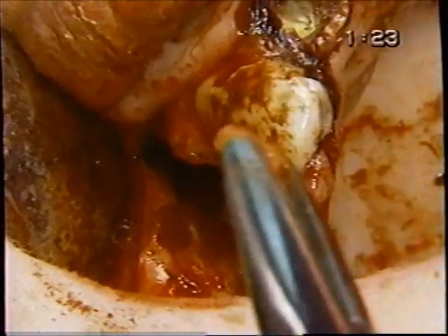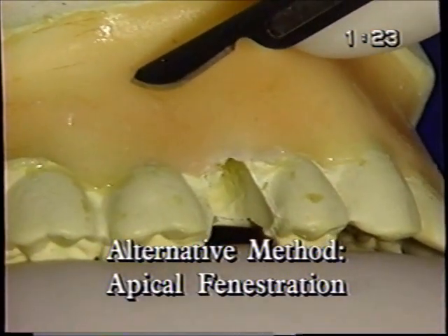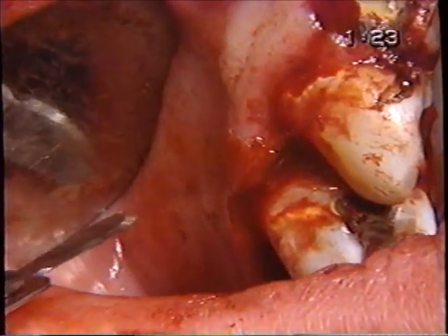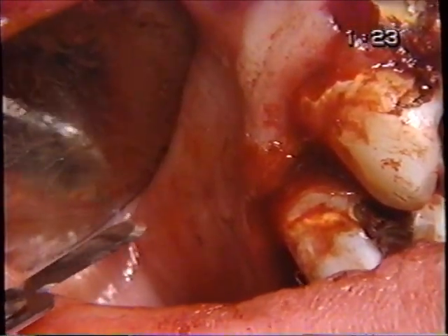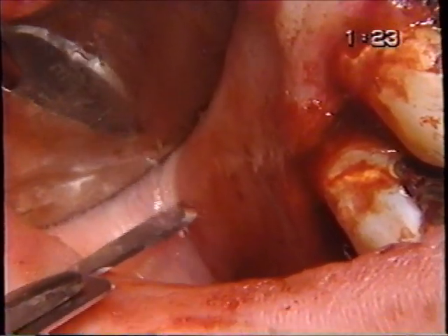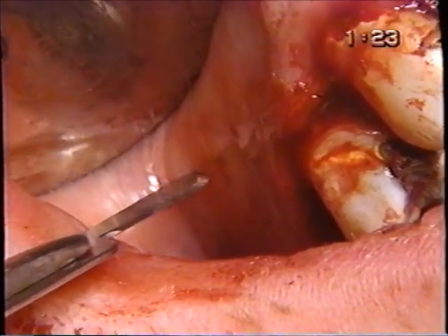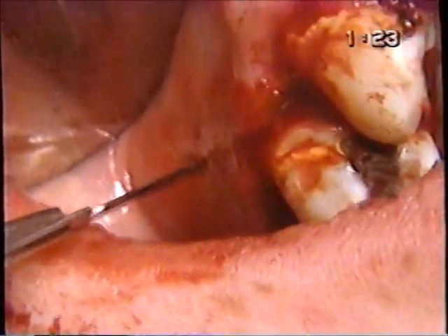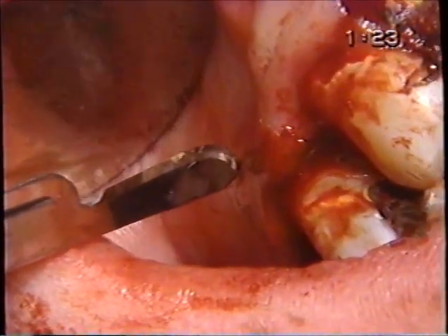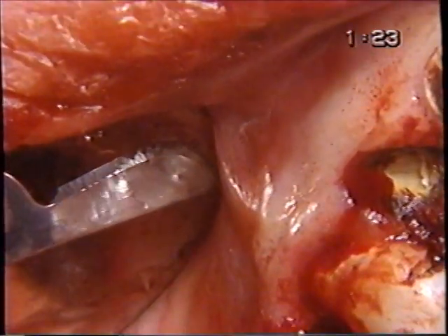There it is. So what we're going to try here is make a semilunar incision, and let's do that, shall we? What I would do would be to start at this point where you see the scalpel, maybe half a tooth away, and at the depth of the vestibule, and I would come in a semilunar shape, maybe 5 millimeters or so from the free margin of the soft tissue, and then come over about 1 tooth away on the other side.